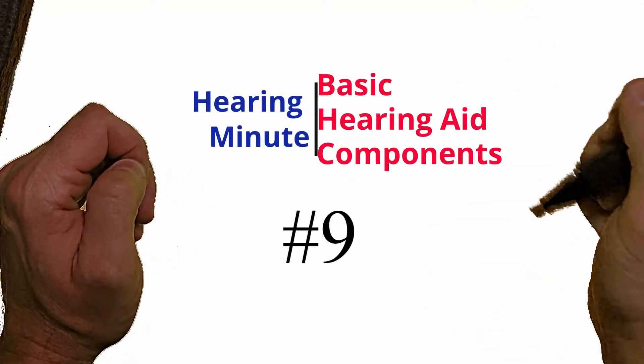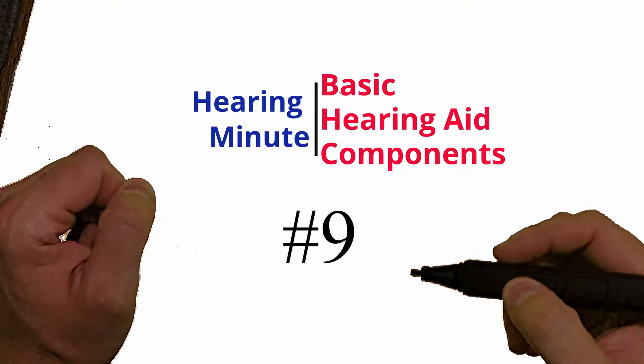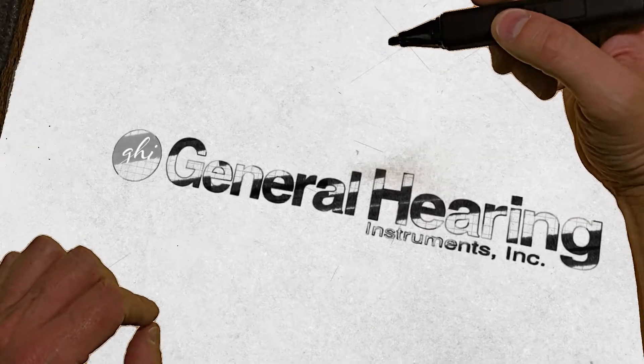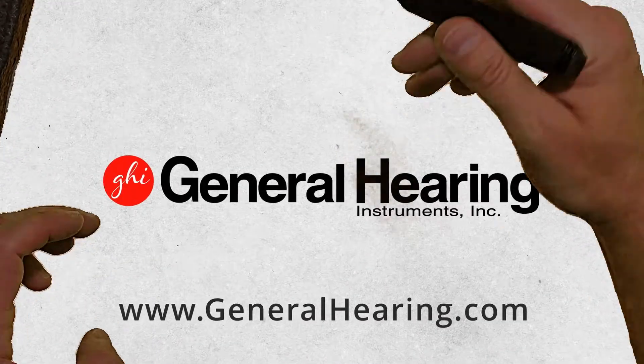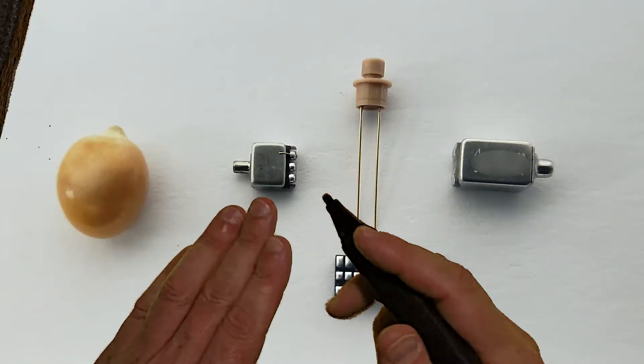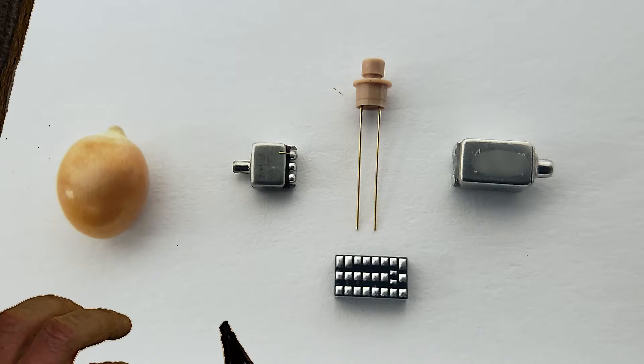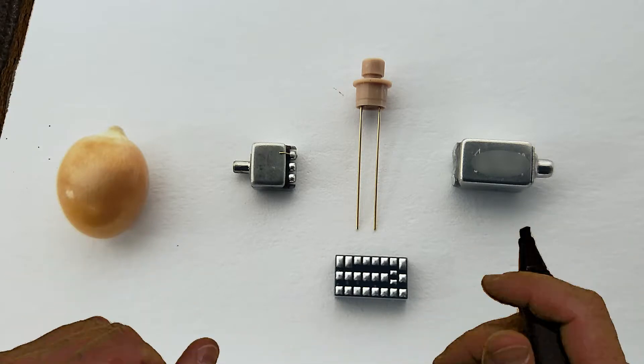Today we're going to be discussing basic hearing aid components. To give you an idea how small the components of a hearing aid are, here's a kernel of popcorn. That gives you a reference of how tiny these components are.